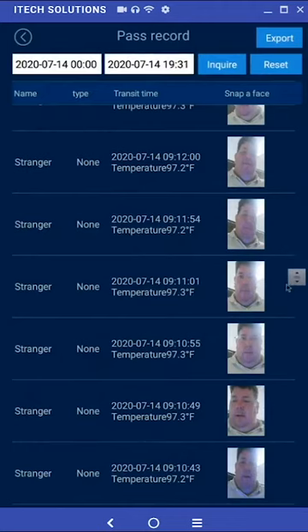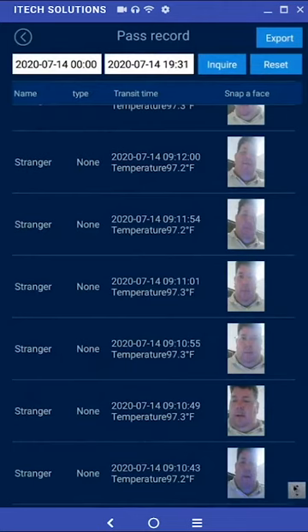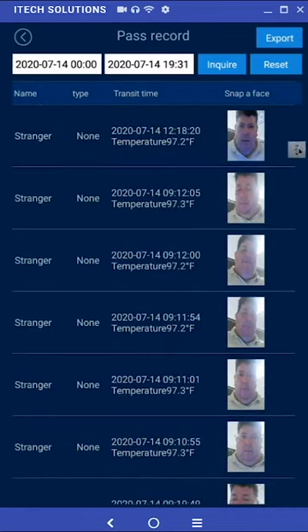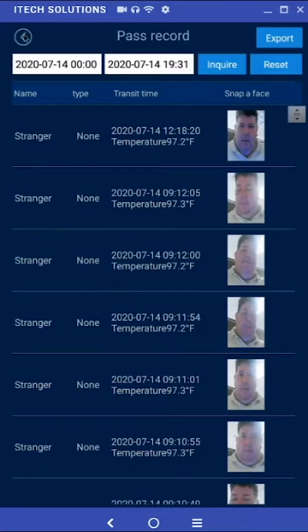You can also set a search parameter for desired dates and times and then export this list to a connected USB storage device. Unregistered users or strangers will not be saved in the pass record unless the default changes are saved.